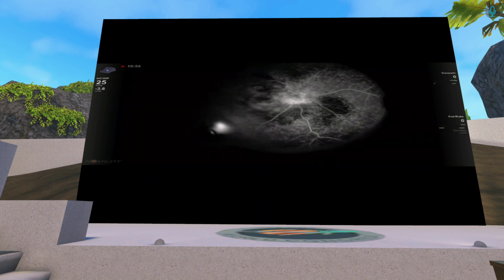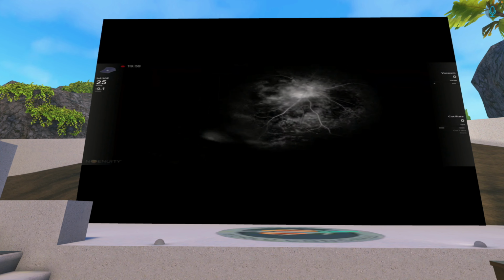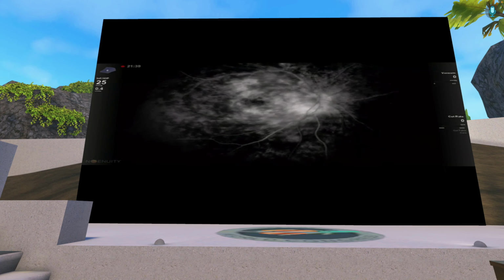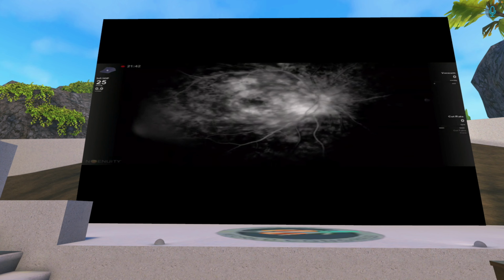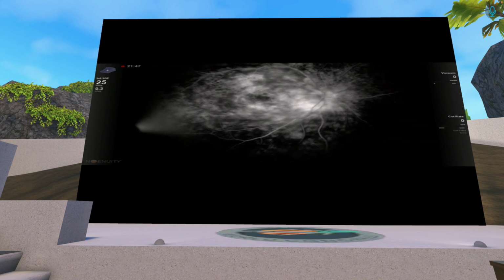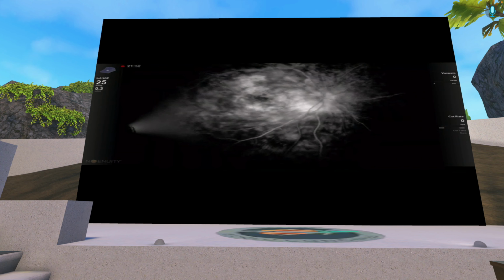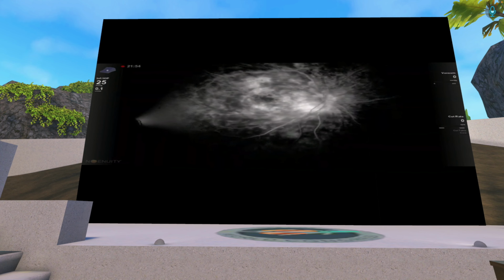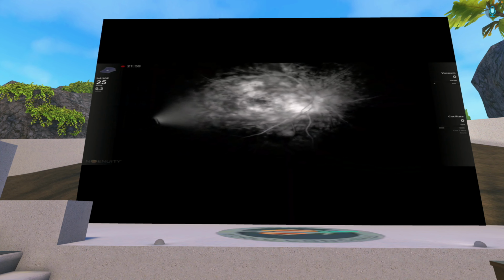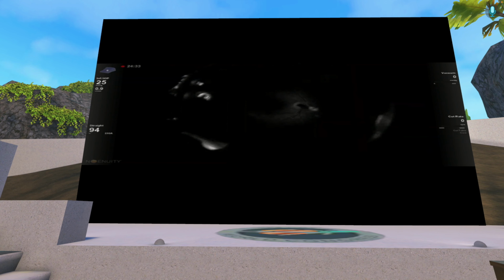So what I need to show here is actually the contrast and the data separation that we need to aim to have during intraoperative FFA. Otherwise, if we see only the big vessels, we might miss areas of non-perfusion which are on the level of the capillaries or on the level of the choroidal circulation. So you can see here the macular region, and this was the first case.